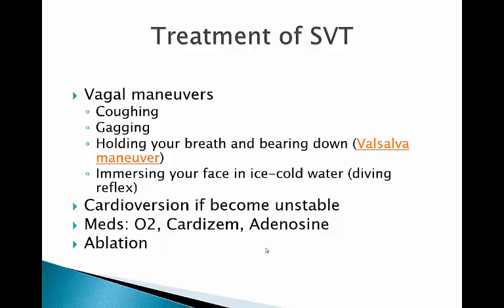Okay, now we're going to talk about cardioversion later on, but cardioversion would be to get a patient out of an abnormal rhythm. Okay, defibrillation is when the patient's heart has stopped and we're shocking it to get it to start again. Okay, that's defibrillation. The big difference between the two is cardioversion is about 50 joules and defibrillation can be upwards of 300 or 360 joules. So cardioversion is a mild shock to get a patient out of an irregular rhythm. Defibrillation is a major shock to restart stopped cardiac muscle. All right, so that's the big difference between the two.